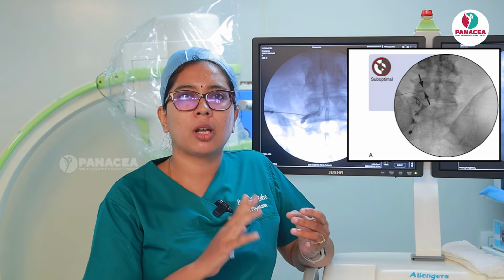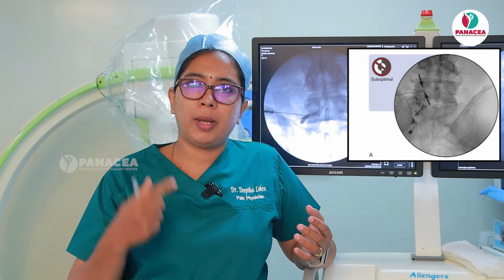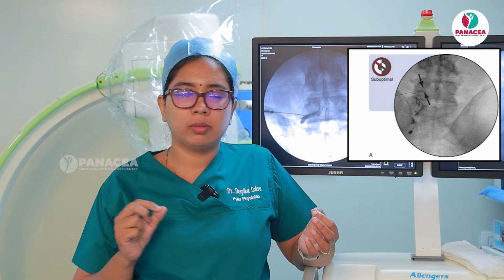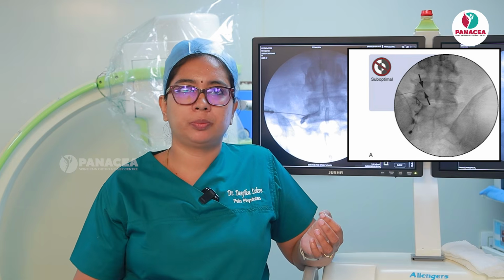As soon as the patient complains of pain, as soon as the patient says that he is having radiating pain or shock-like pain which is radiating to the leg, immediately stop. Don't give the dye anymore, and please do not give the drug, because that can cause direct nerve damage.